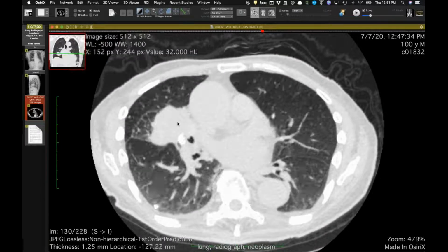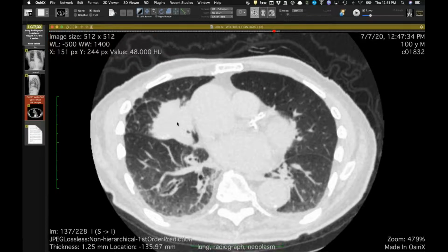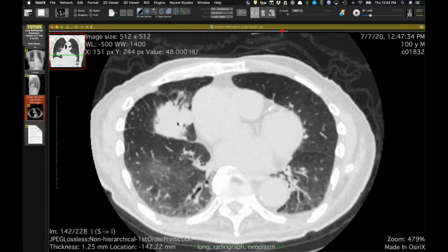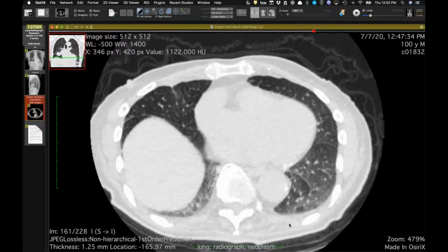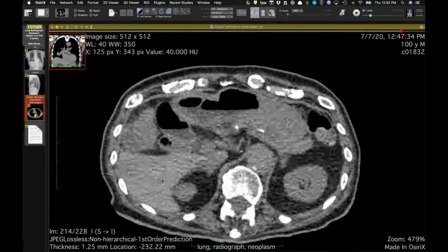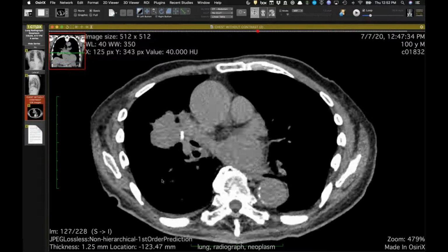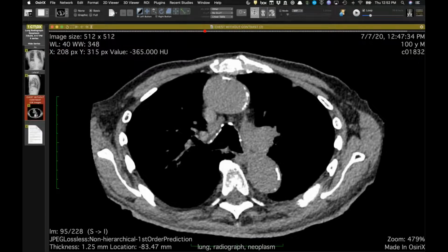So we don't have any confirmation on this. I doubt we will get it based on his age, but it certainly looks like a big lung cancer. And he's got tons of tiny little nodules everywhere. So he's got bilateral lung nodules, so that would be M1A, plus he's got at least one bone metastasis, and I think he's also probably got some liver lesions, even though we only got a non-con CT of his chest. So very good observation. I thought it's a nice teaching case for that reason.